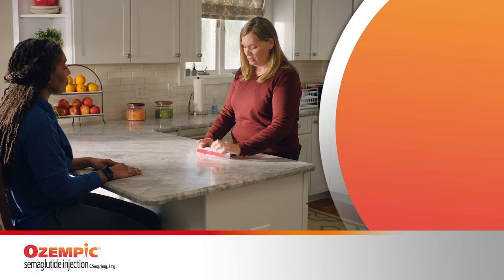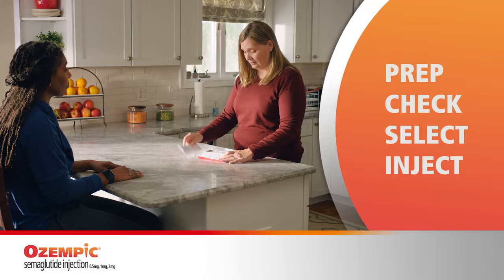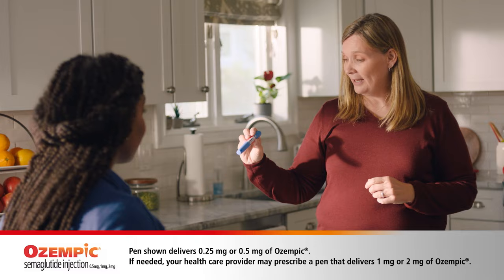I'm almost ready. I just need to take my Ozempic. My husband's starting Ozempic next week. You mind showing me how you take Ozempic? I want to be able to help Sam as much as I can. Of course. I found the instructions simple to follow. All you need to do is prep, check, select, and inject.